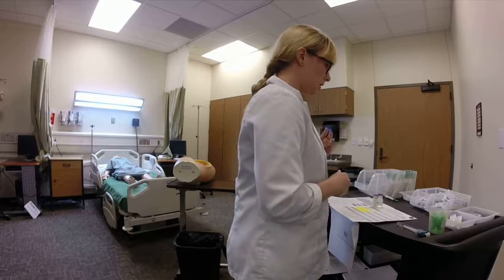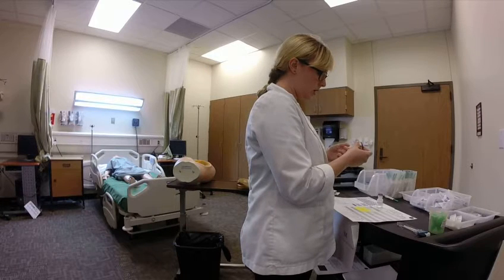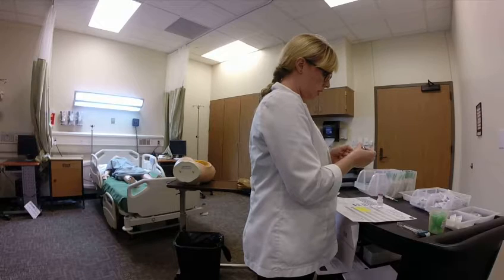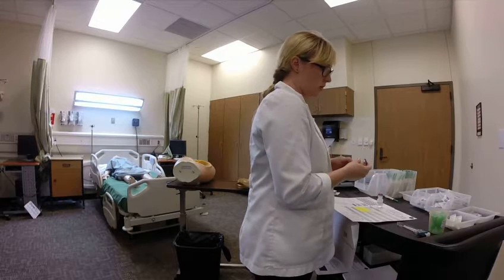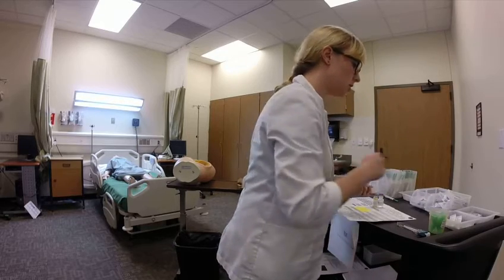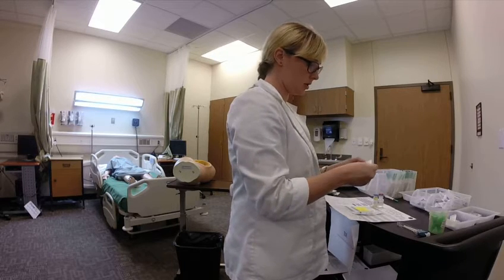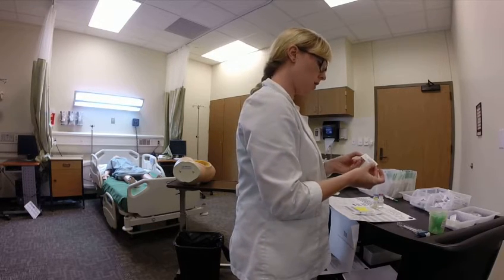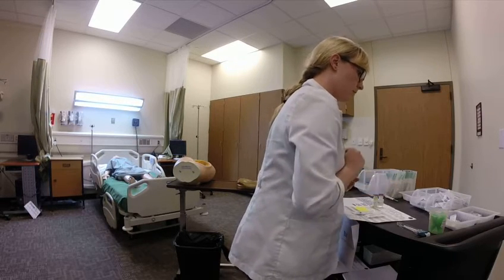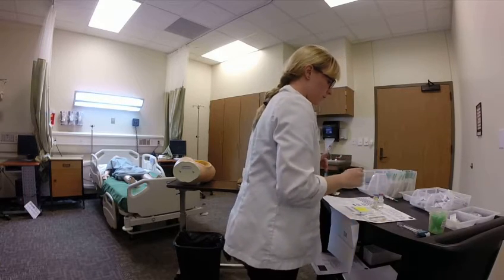Now I'm going to get all of the supplies I need. Reading my label, I know I'm going to be diluting with 2.1 mils, and then after that 1 mil equals 350. So I know I can use a 3 mil syringe for the entire procedure. I've got my 3 mil syringe. My patient — I met her this morning when I did my assessment, she's a small patient — so I'm only going to use a 1-inch needle for the IM injection, and I'll use a 23 gauge. I'm going to grab two of those: one to mix all of my meds, and then the other one for the injection.